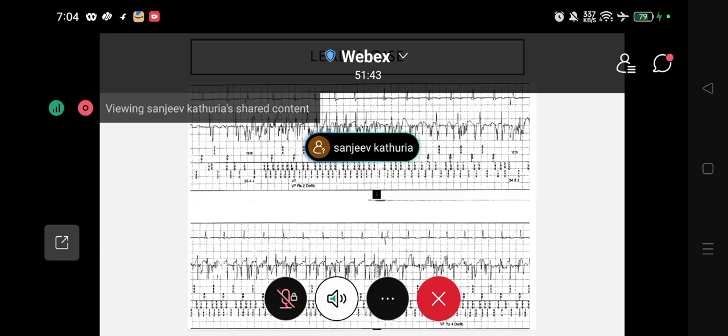This is such a good example of the machine being so good. Till the time it was VS, ventricular sensing, it was using its discriminators. What are the discriminators? Rate. What is the rate achieved? Rate is less than VF. It will say, okay, I'll start it. Is it regular? Is it a sudden onset? Is it matching the morphology? It is doing everything, but not giving a shock. As soon as the rate goes into the FS zone, fibrillation zone, it closes everything. It says now shock to be given.